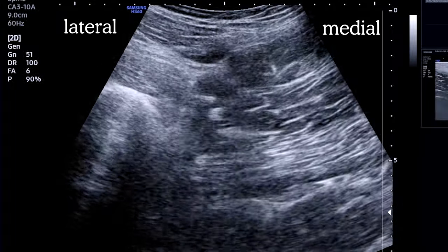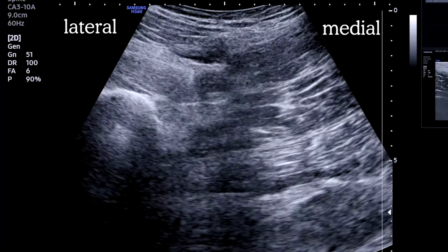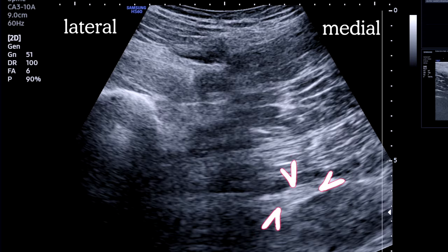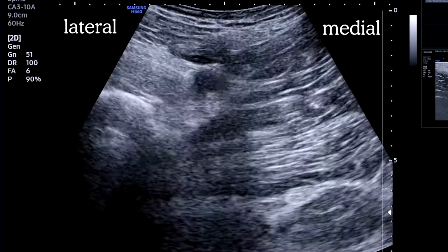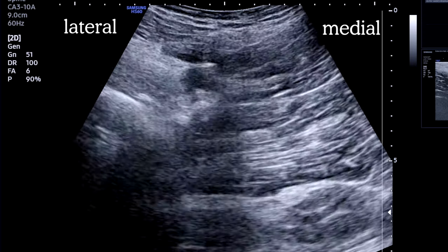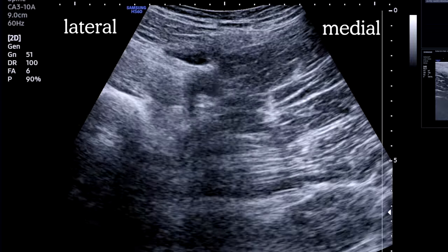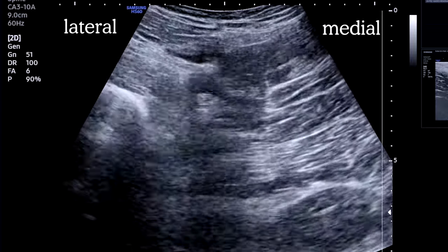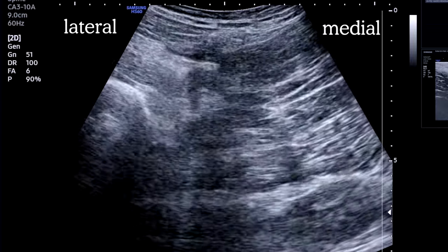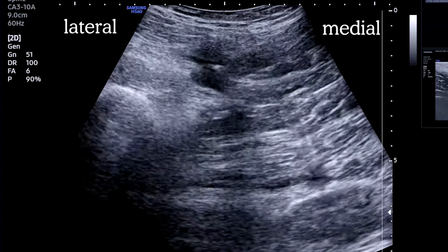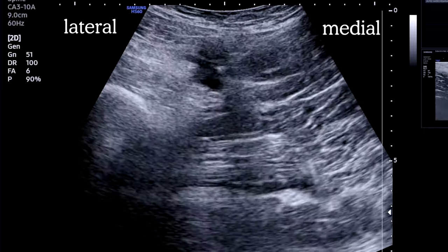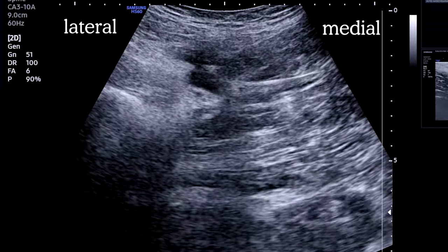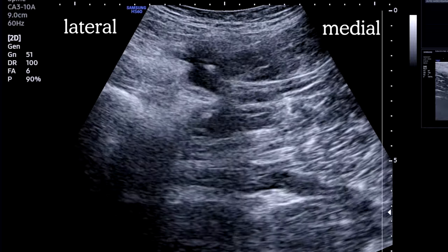Let's check out the out-of-plane approach. Same initial image — and here's our nerve. Our needle is approaching out-of-plane, medial to the femoral vessels. You can appreciate the tissue distortion, which gives you the vector. We snap into the plane, aspirate, and begin to inject.